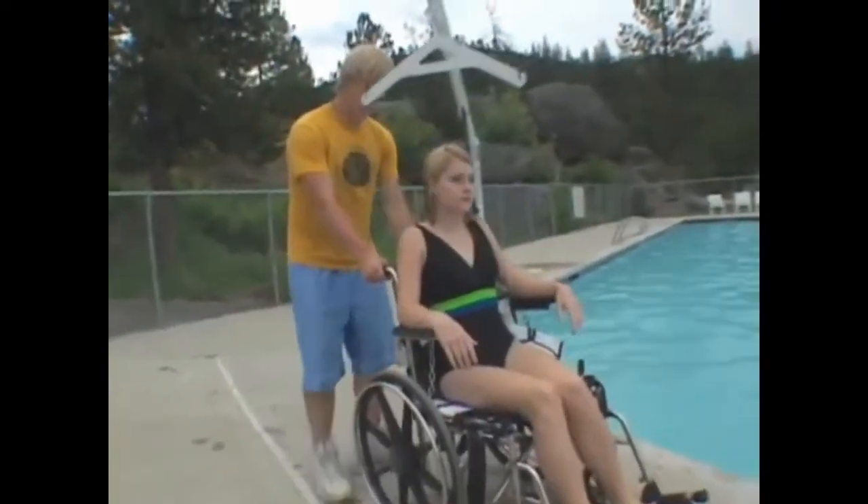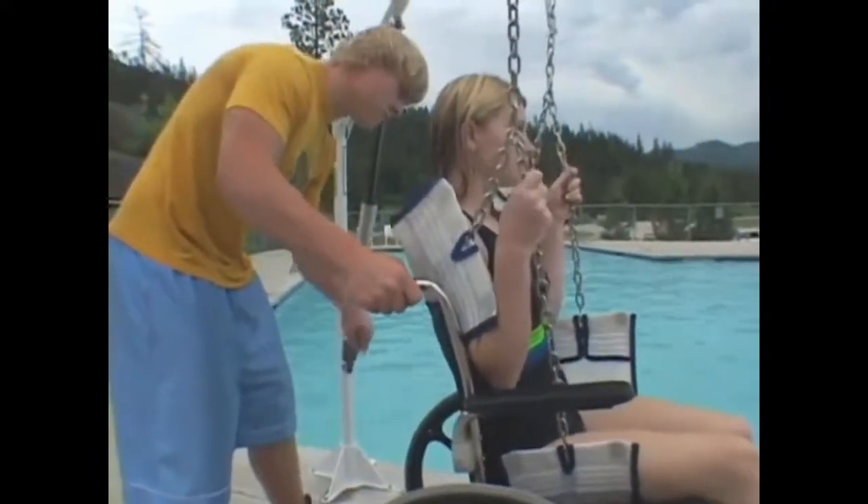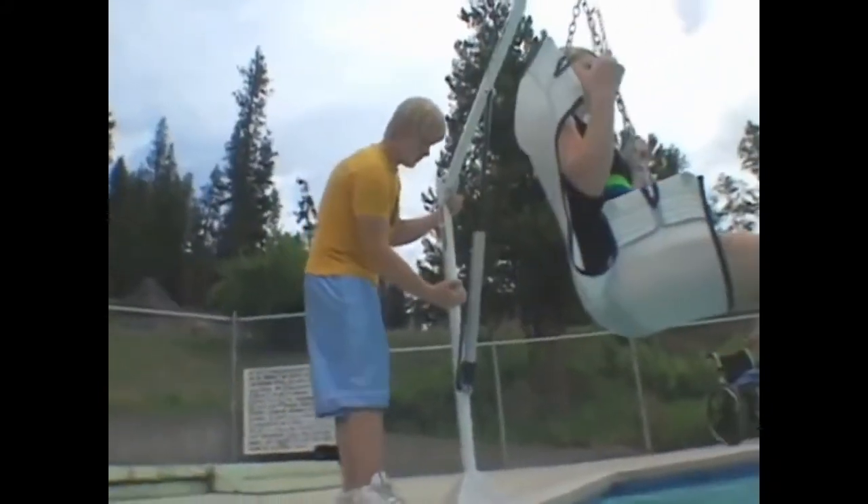The Easy Pool Lift is designed for residential customers who need a quick and affordable solution to pool access. The Easy is capable of supporting up to 400 pounds. The standard sling seat conforms to the user's body, providing comfort and security.